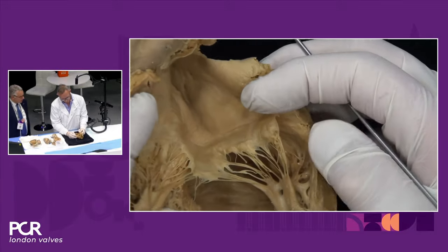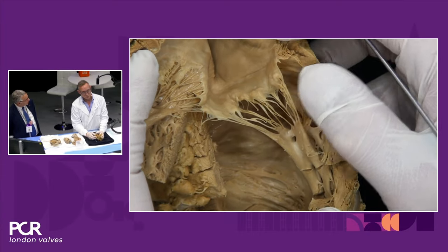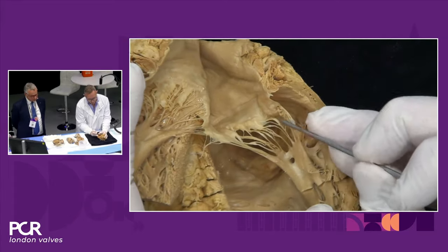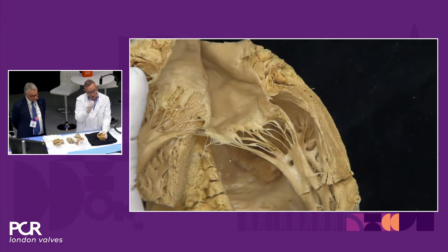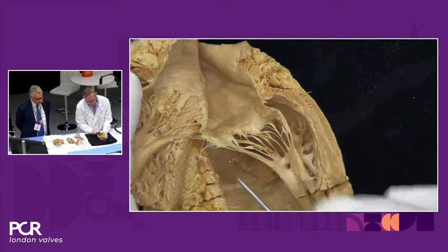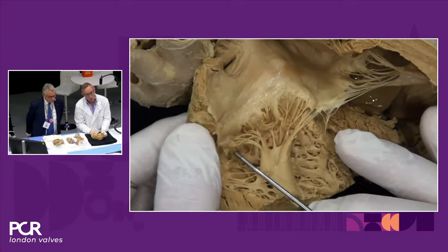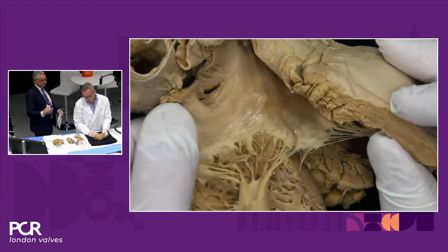But even in this complex anatomy, you already realize that the chordal distribution is a little bit more simple to interpret than in the tricuspid, correct? I mean, you have a larger chordal-free zone here. I mean, the posterior leaflet is a challenge. So what you'll have is you'll develop hooding between the chordal attachments. And you can see that here. So you have small regions, maybe 2 or 3 millimeters, in between those hoods. Sometimes they're larger than others. Then you do have a fairly chord-free zone in the center of the anterior leaflet there. But you've got multiple chord-free zones. I think that's the point. And you have this sort of space between the small hoods.